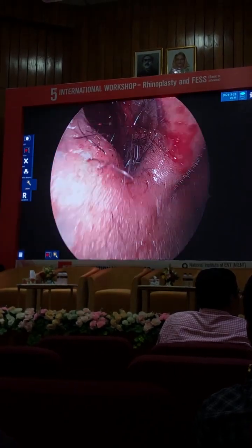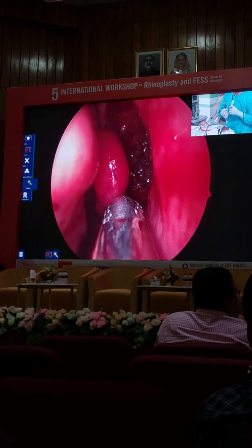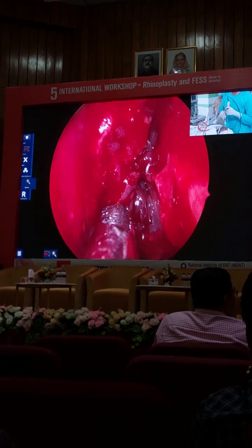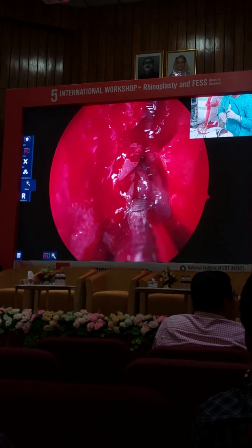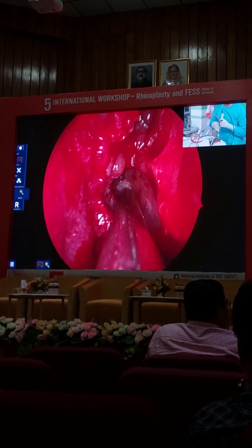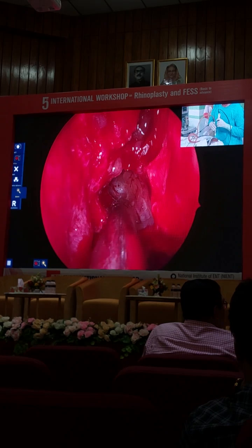Now you please demonstrate the anatomical landmark at present. Middle turbinate, maxilla laterally at 4 o'clock, ethmoid, ground lamella, frontal above. We are now going through the ground lamella into the posterior ethmoid. And the back is the orbital apex.